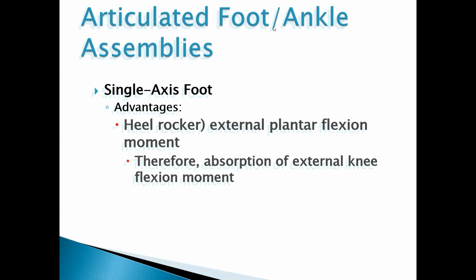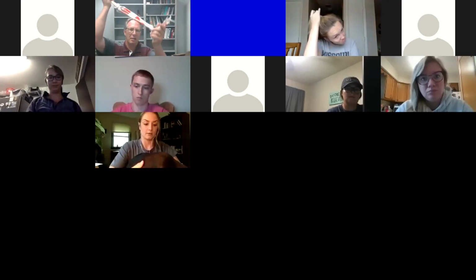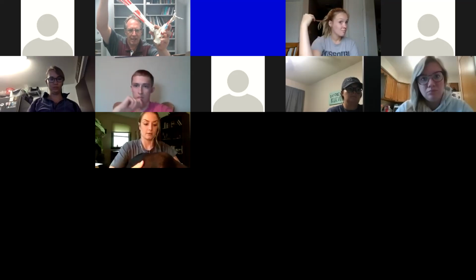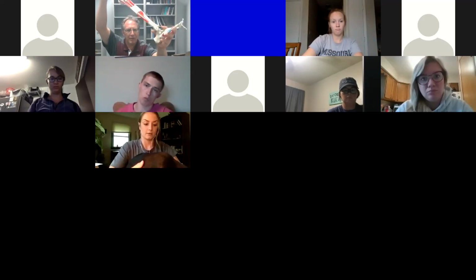And again, I'm going to unshare for just a minute so we can see this. Okay, so if the ankle is stiff, then you contact with the heel, it brings the tibia right forward. But if the ankle can move, then the foot can plantar flex.